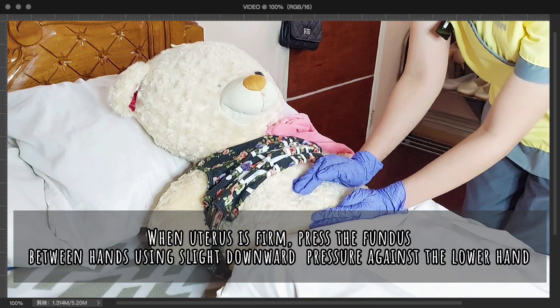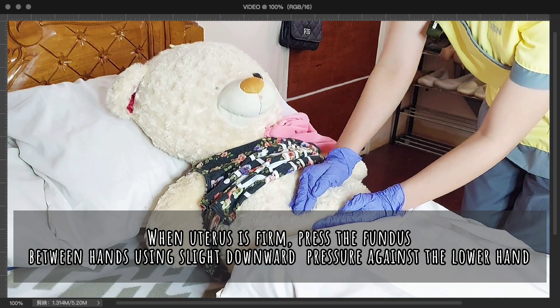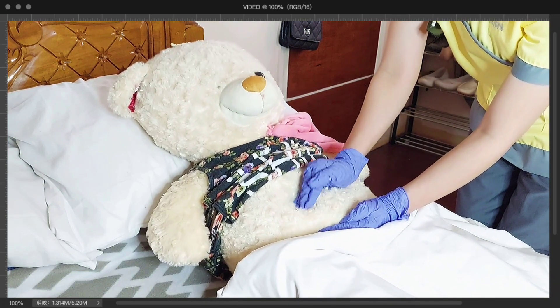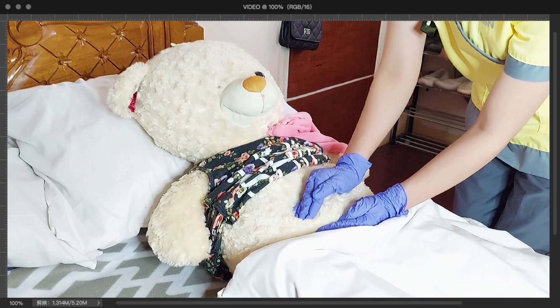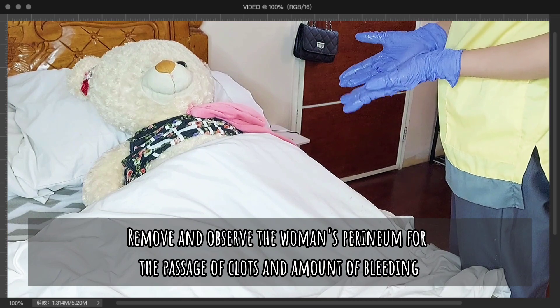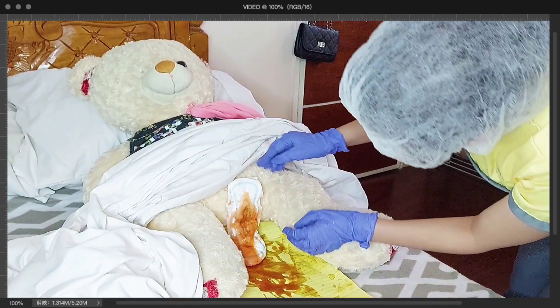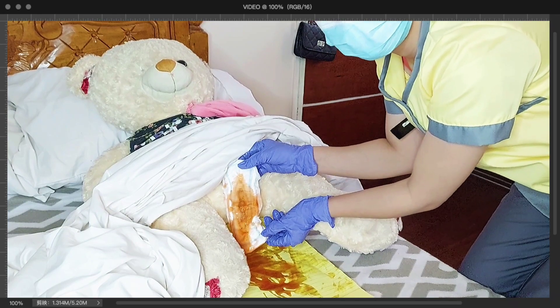Ma'am Max Payne, I can feel that your uterus is firm. I will now press your fundus between my hands with slight downward pressure against your lower hand. Gently squeezing with downward pressure helps to expel blood clots collected in the uterine cavity. Please allow me to check here in order to remove the passage of clots and estimate the amount of your bleeding. This will help to assess the degree of bleeding of the patient.